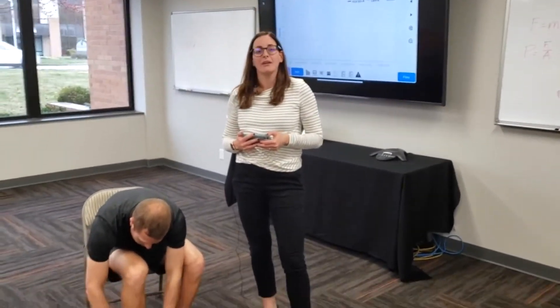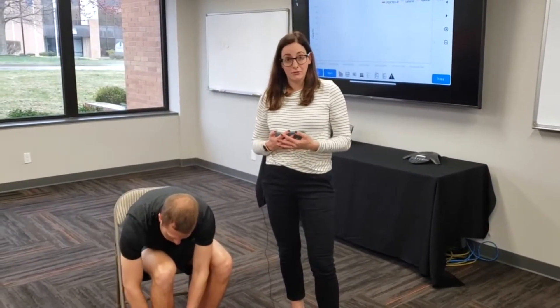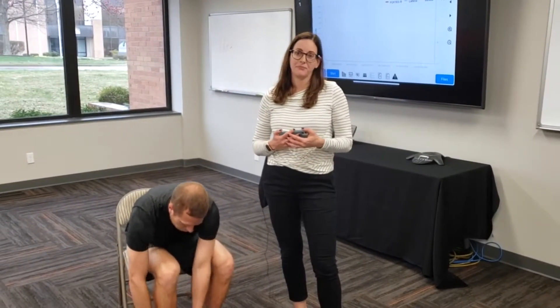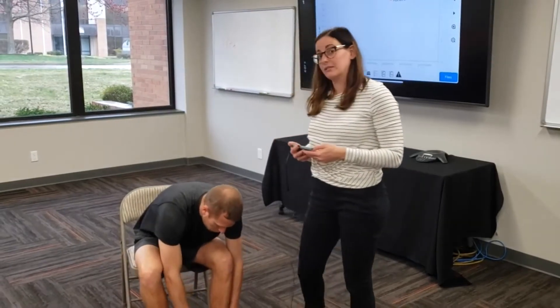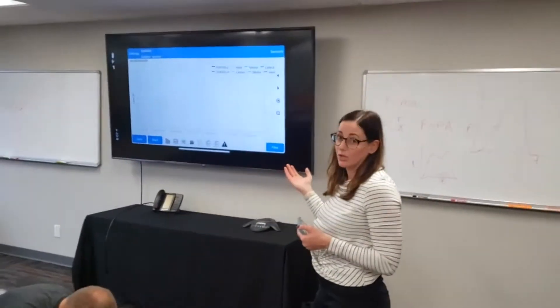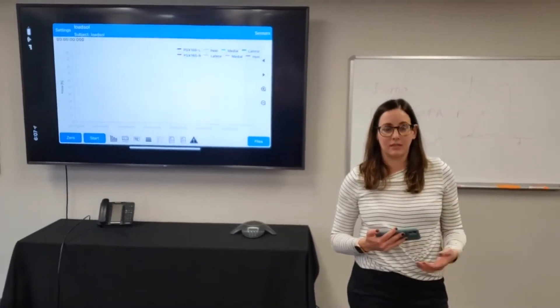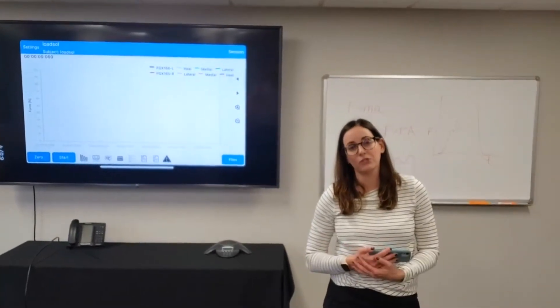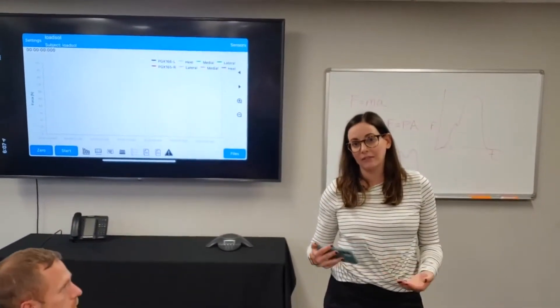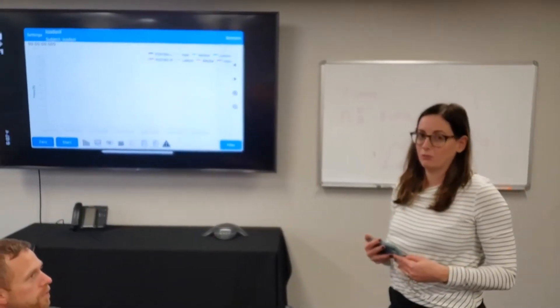We have an Android and iOS compatible app. These can be used with either a mobile phone or a tablet. Today, we're going to be using the iOS app, which is also mirrored here onto our larger screen. This allows both easy viewing for the clinician or researcher working with the athlete or patient, but also to provide feedback to the individual being measured.